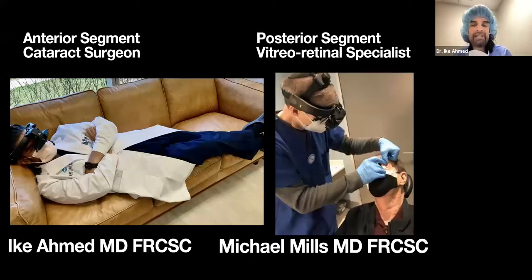This will be interesting because I see that most people are examining. Some are using the direct, about 1 in 10 respondents. And I'm gonna share this very soon. You're not able to see the results yet, but you will see them shortly. And it looks like the majority are primarily using slit lamp lenses, with similar amounts using binocular indirect, but it looks like not everybody is using binocular indirect for diabetic patients.